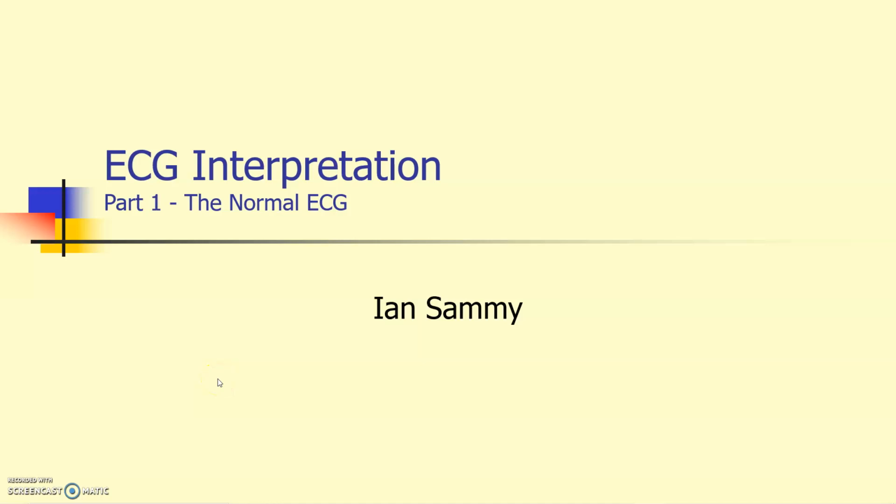ECG interpretation forms an integral part of your Part 1 curriculum. This series of 4 lectures gives you a basic introduction to the interpretation of ECGs. It is not intended to be all comprehensive, but should allow you to provide a structured approach to the diagnosis of 12-lead ECGs and come up with a reasonable differential diagnosis of the common things that you're likely to see.